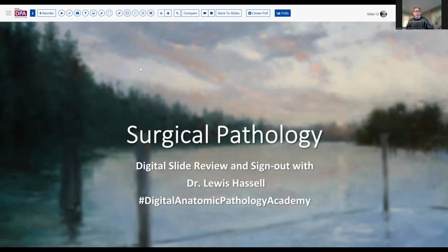Our cases come from both the archives of Path Presenter and the Digital Pathology Association, as well as from my own practice at the University of Oklahoma.